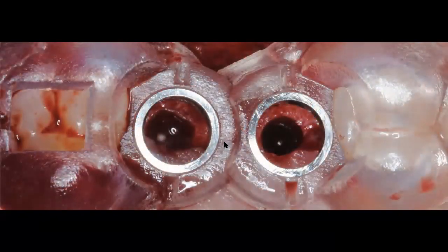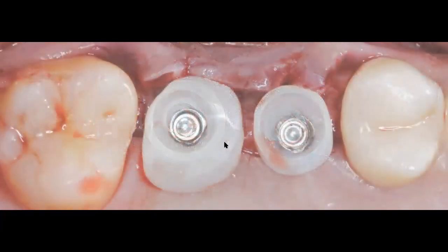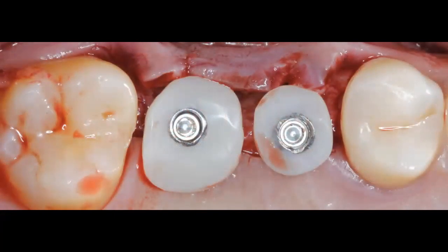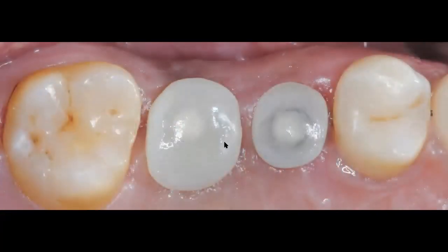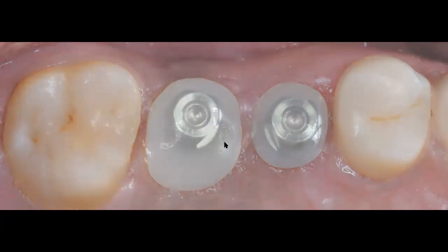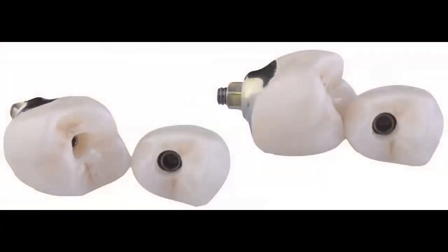This is my completed osteotomies, my implants delivered within these sites, and there are my custom healing abutments. So I had all the tools I needed right then for me to perform my surgical procedure, place my healing abutment, suture, and then go ahead, wait 4 months, make my final impression, send it back to Oral Arts, and have them fabricate these screw-retained zirconia crowns.